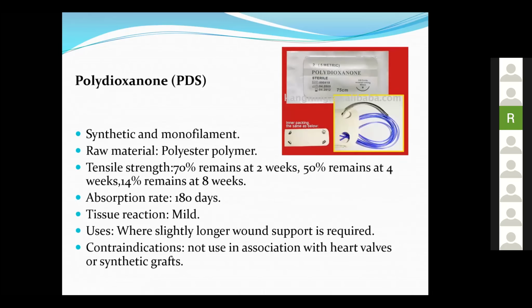The other thing is polydioxanone, PDS. Its absorption time is longer. It is also monofilament, but the indications are more or less the same as Monocryl.